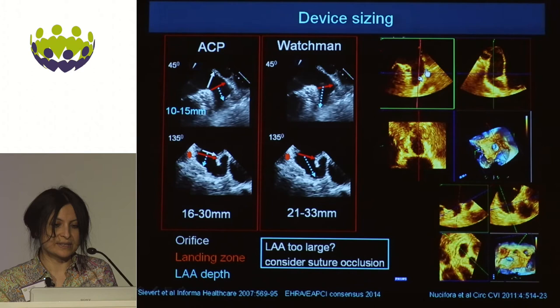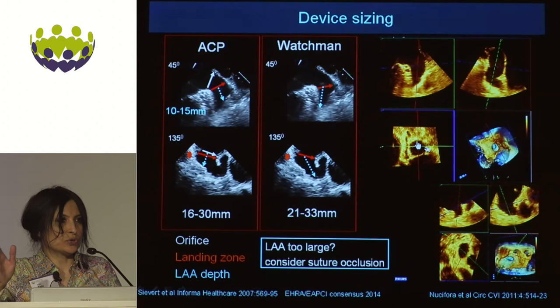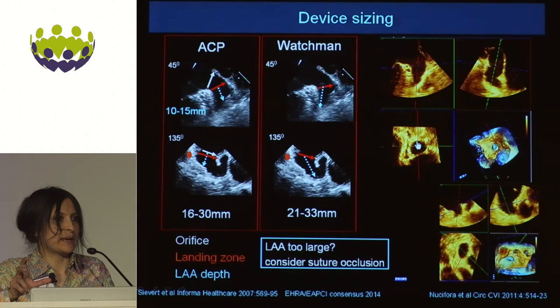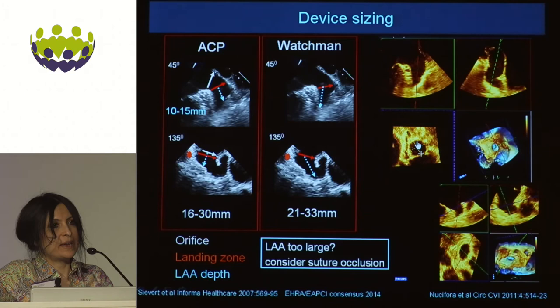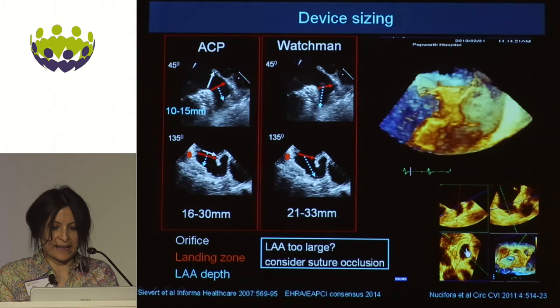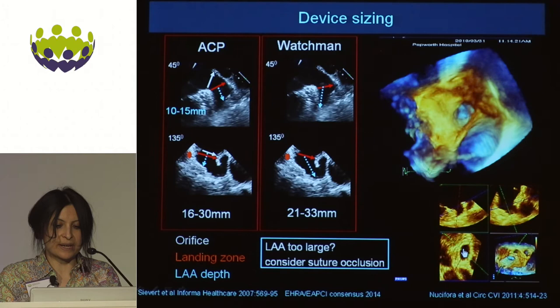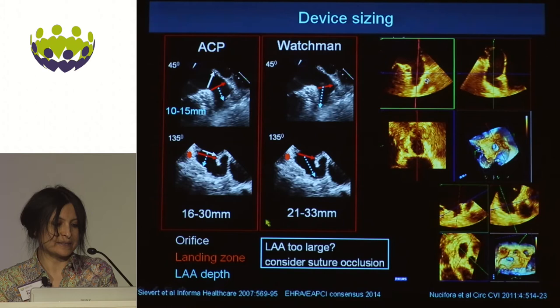When it comes to measurements, we use 3D imaging. The data suggests that the orifice is not usually round — it's usually oval. For the Watchman device you go for the largest diameter, usually based on any point in the cardiac cycle where the landing zone looks the biggest. For ACP and Amulet, we tend to use an average of the orthogonal planes — the shortest and the widest — and take an average of the two. If the appendage is too large, then the Watchman or lariat is something to consider.